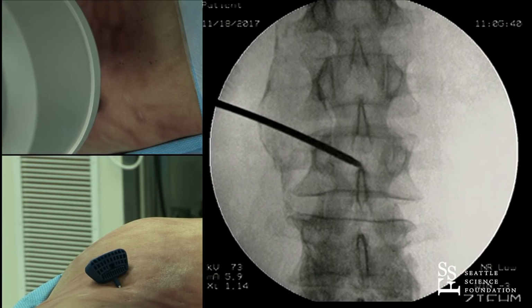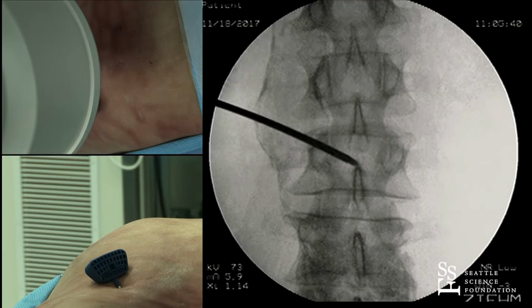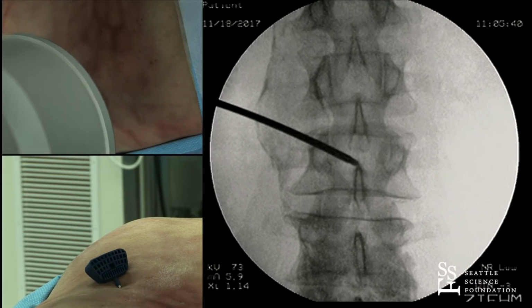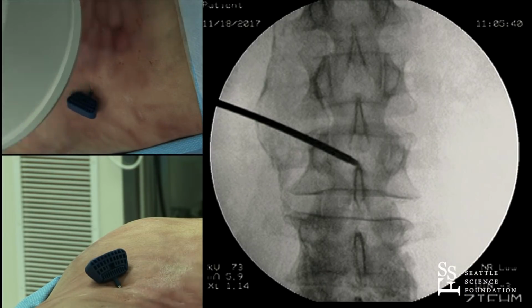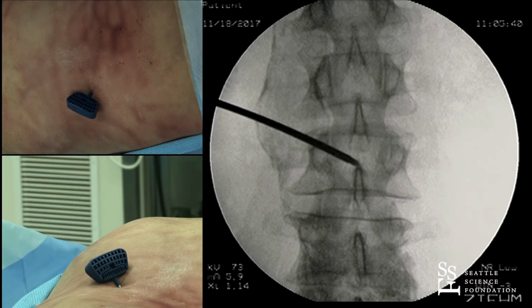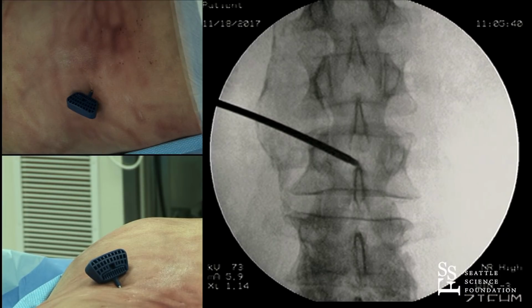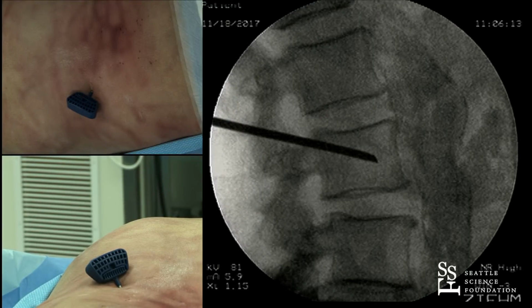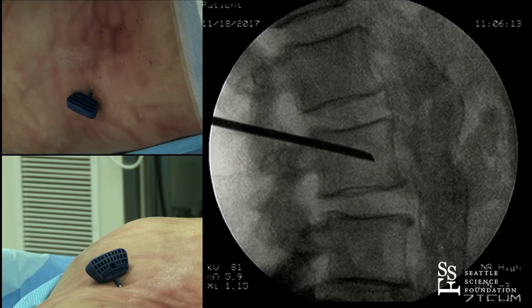We'll save that one. And this is designed to do unilateral vertebral augmentation by putting the needle smack in the center of the vertebral body, because your goal for unilateral vertebral augmentation is end-plate to end-plate fill in the center of the vertebral body. The biomechanical data says that's where you get the best results, so there you go: mid to anterior portion on the lateral view and mid portion directly in the AP view, perfect position.